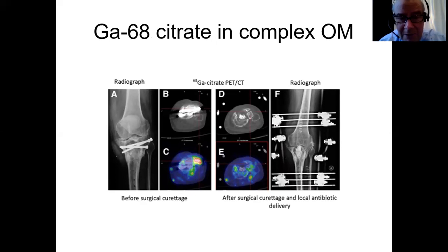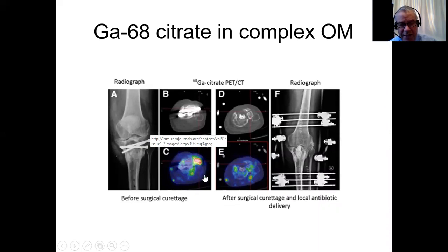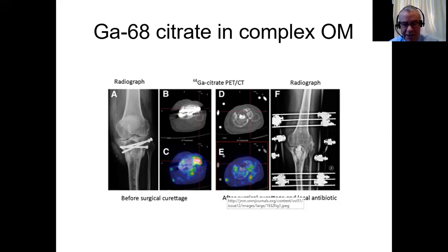And this is an image from their paper in a patient who has, so a couple of patients having fixation, and this is done more than 3 or 4 weeks before. So when you get this intense uptake, it's unlikely to just be post-operative. And then after they did the surgical procedure, they found this intense uptake had disappeared. But if you notice very carefully, there is low-grade uptake of gallium-68 citrate related to all these other surgical implants. So it's not really specific for infection. So you need to look carefully and read the scan carefully.